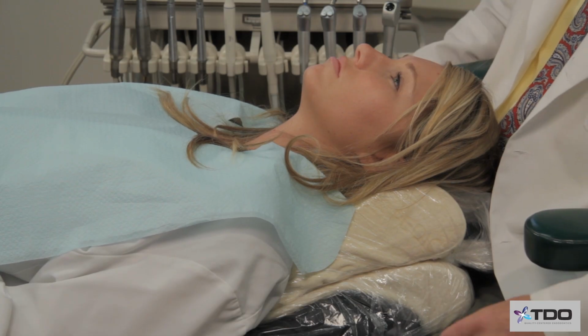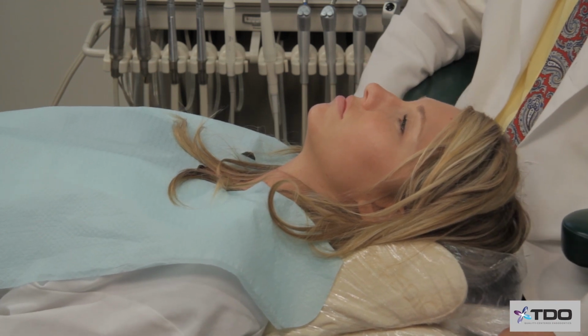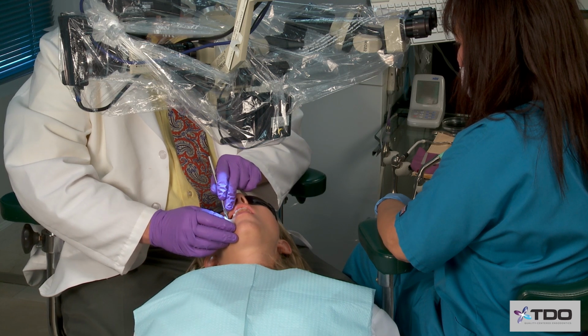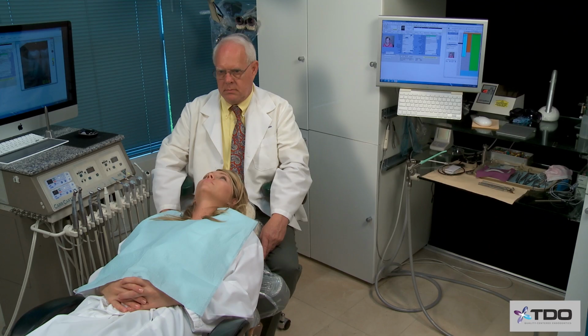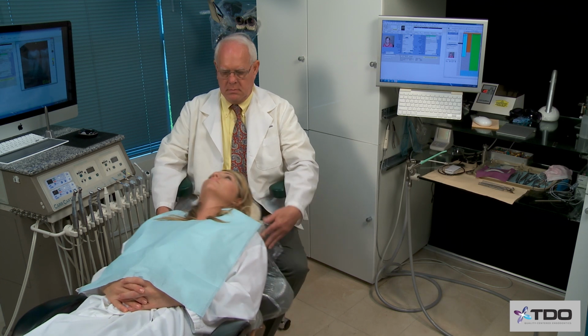One of the learned skills is learning to move the patient chair with your legs and not move the scope, as demonstrated here. In the specific skills chapter of this DVD, this is covered in quite some detail. Obviously, moving the patient in this way cannot be done without an appropriate chair.